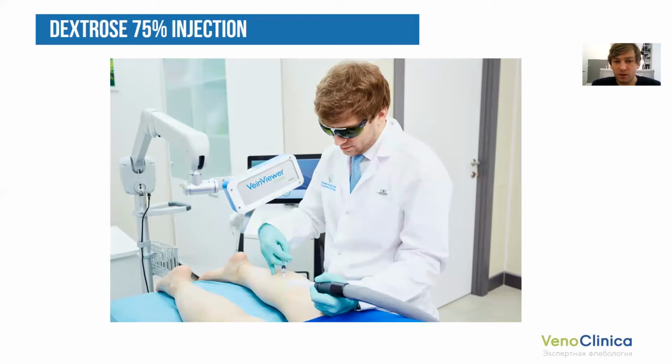After the percutaneous laser, you need to immediately inject 75% dextrose, because the vein has a smaller diameter and there is inflammation of the venous wall. You need to inject the 75% dextrose very slowly; it's quite a good sclerosant, but not as strong as detergents.